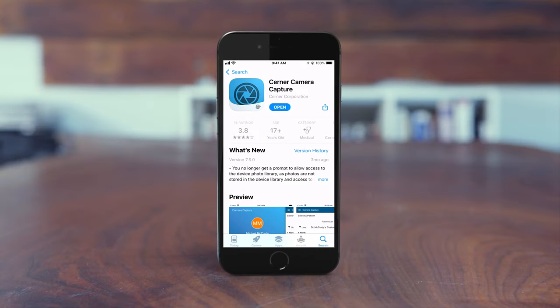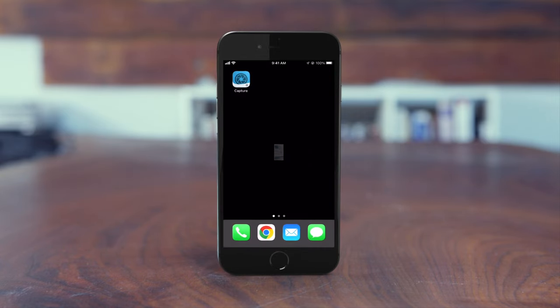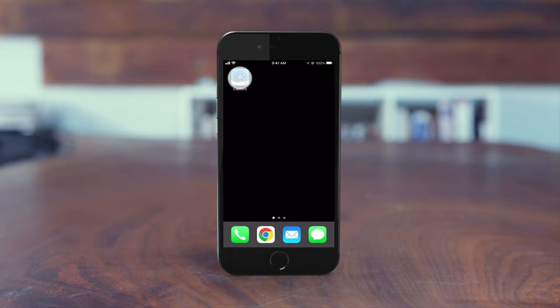Use Cerner Camera Capture to securely acquire and store clinical photos in the patient record. Download Camera Capture to your personal device from the Apple App Store or Google Play.